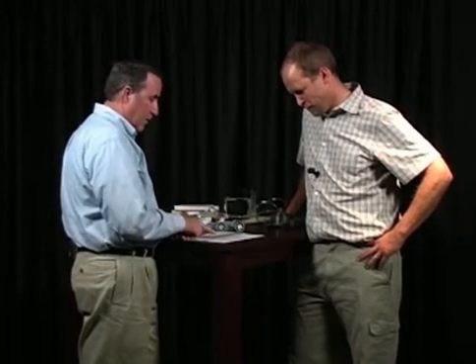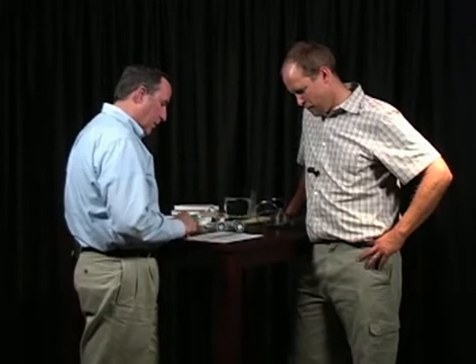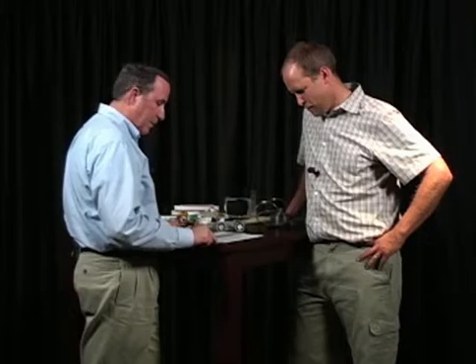The next thing we want to talk about are allergen samples. Allergen sampling takes a different chain of custody, quite different. There's no flow rate and time, but there are places where you record the sample location and the sample number. These don't come with serial numbers.